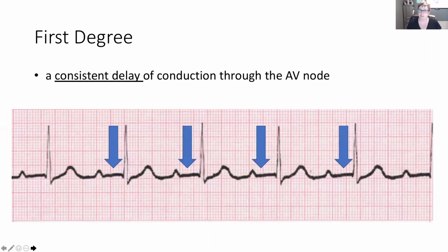So when we look at our ECG rhythm strip, what we notice here is after the P wave, there is a longer span before the QRS complex fires. And it is that longer span that's indicating that the PR interval has widened and the AV node is holding on to electricity. Now recall that isoelectric line, this flat line here, that is time when there is no electrical movement in the heart. And so we have our SA node firing, traveling down through the atrial tissue, getting to the AV node, and wait and wait and wait, and then it releases.